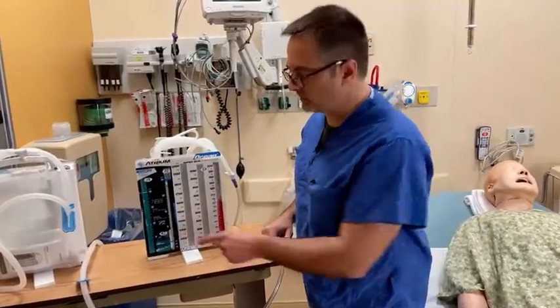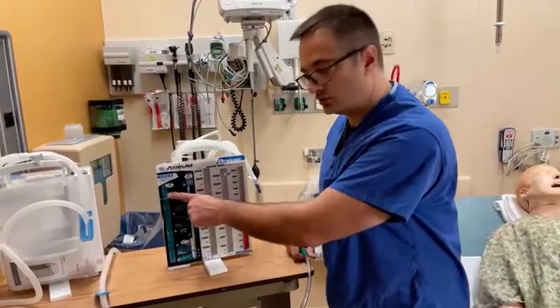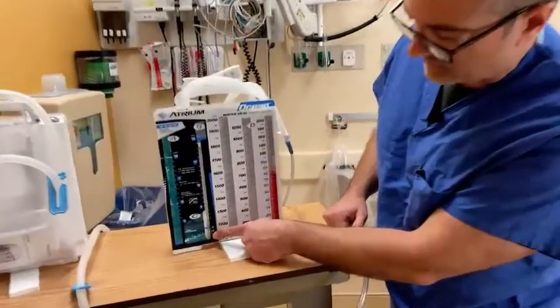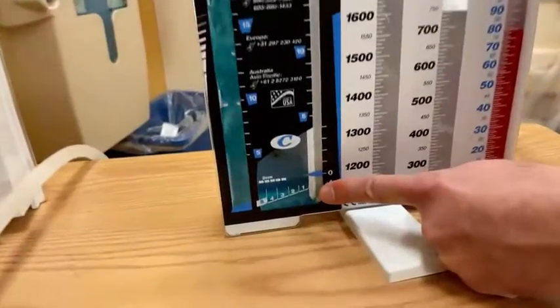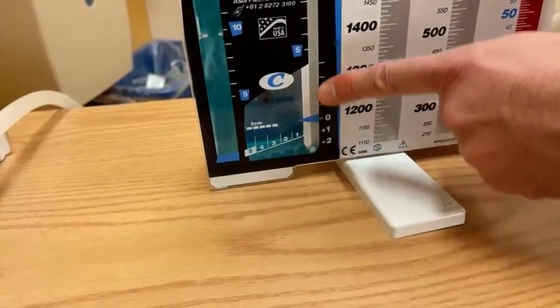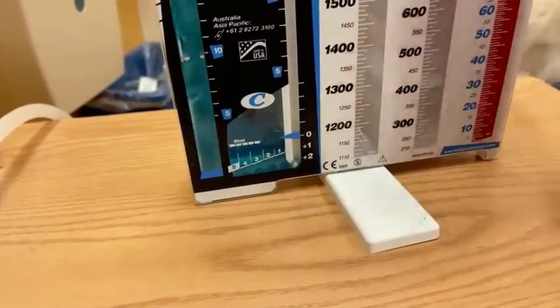Now you can see that there's a lot of bubbling going on in my suction control chamber. And if you can see, there's a little bit of an air leak here that's bubbling down here in my water seal chamber. That is the float ball we were talking about that sometimes you will see periodically rise and fall, which is called tidaling.